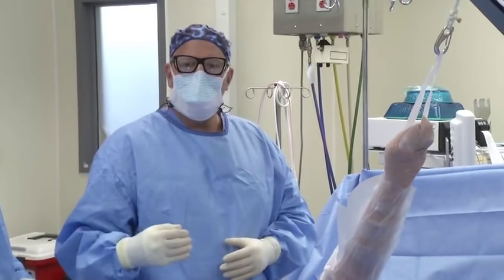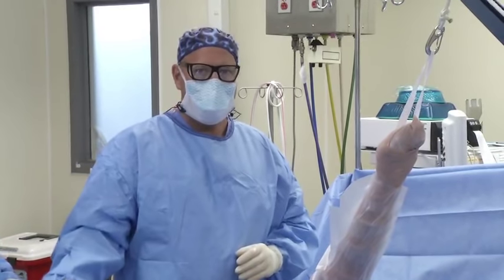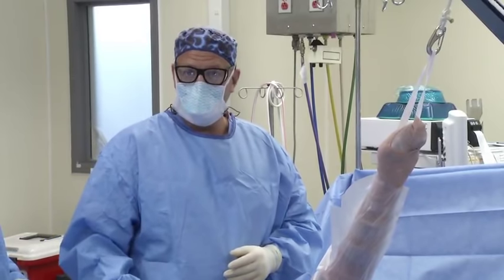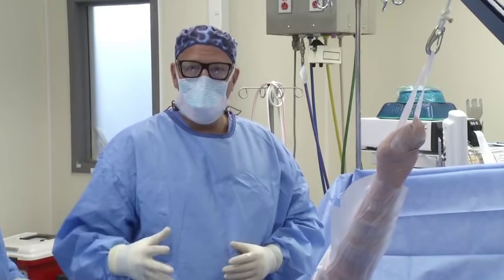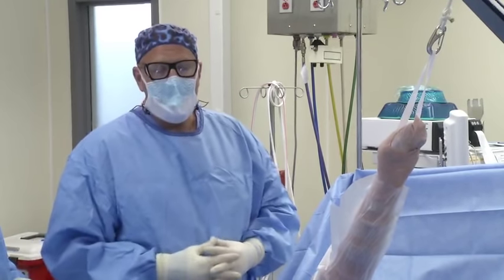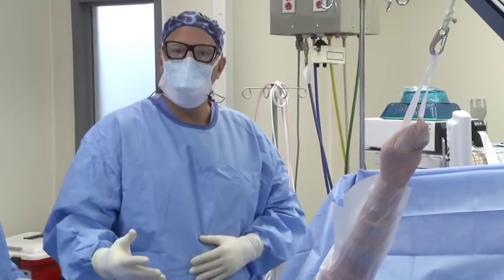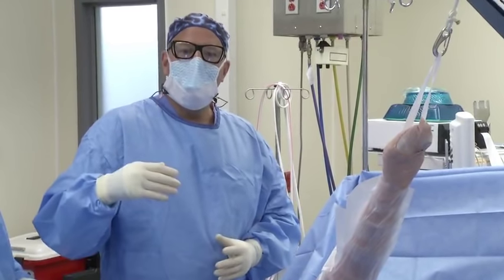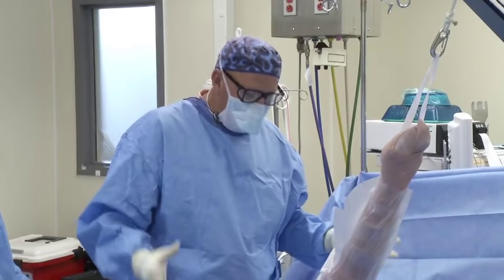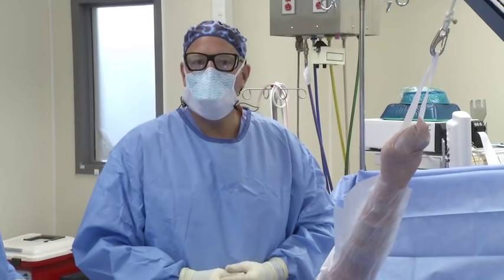So the goal here is to obtain motion, which we did today, and then more importantly, maintain the motion. So she will start very aggressive physical therapy this afternoon. We will push her motion to try to maintain the gains that we've achieved today. And generally, as we improve the motion, we relieve pain and ultimately improve her function. And as you can see, we did that through a very minimally invasive procedure, and she will start motion immediately.